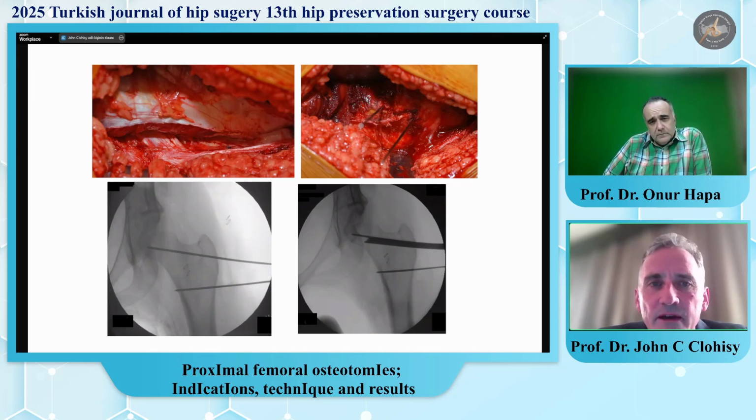This is our lateral approach to the femur. You see the vastus lateralis top left. We incise the fascia posteriorly. We reflect the vastus anteriorly to gain access to the femur. On the top right, you see our guide pins, which are placed to mark our osteotomy line, as well as our blade plate insertion angle and to guide our correction. So those pins are placed in about 25 degrees of rotation to guide our rotation.